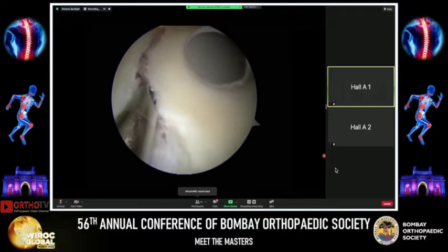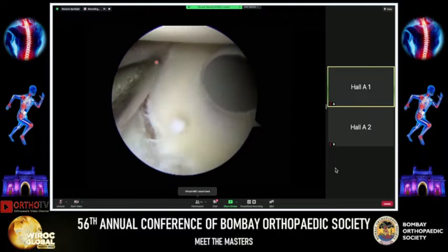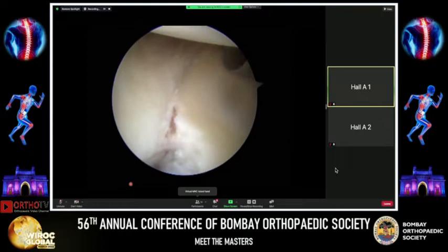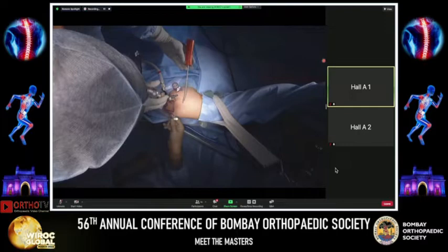I also prepare a one to two millimeter anterior rim of bone bed, removing a very minimal amount of cartilage — nothing more than two millimeters — so the labrum can heal directly onto the bone. I avoid taking too much cartilage. Once the release is complete, using a grasper I perform a trial reduction to determine where the labrum needs to come to achieve good soft tissue tension in the anterior band of the inferior glenohumeral ligament.